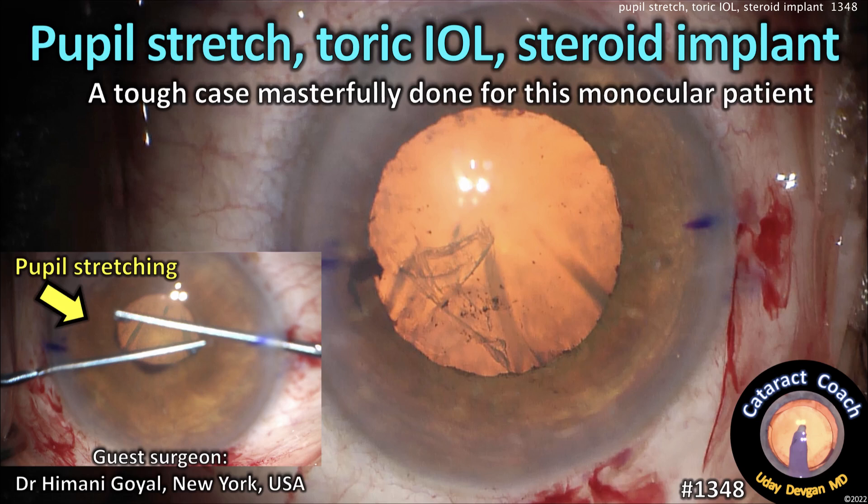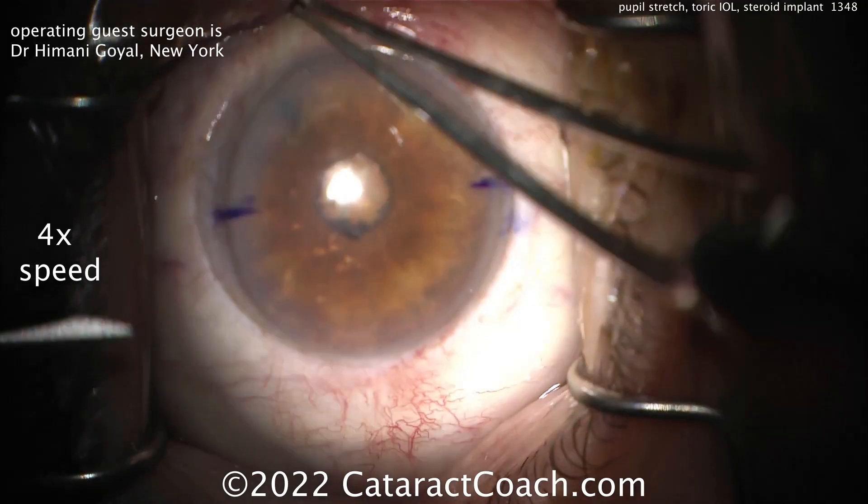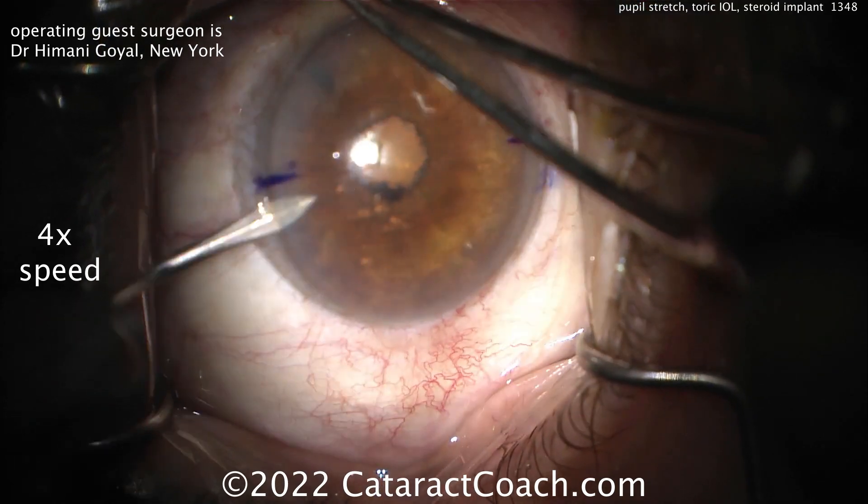CataractCoach.com. Pupil stretch, toric lens, steroid implant. It's a tough case masterfully done for this monocular patient. Our guest surgeon here is Dr. Harmani Goyal from New York City.